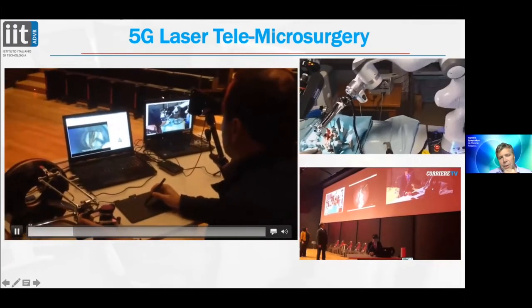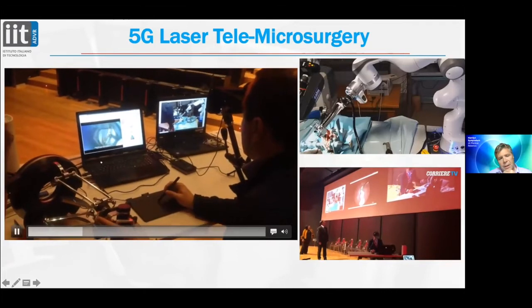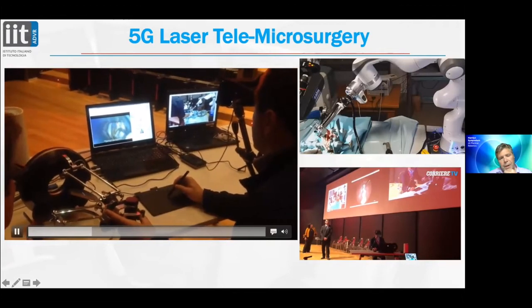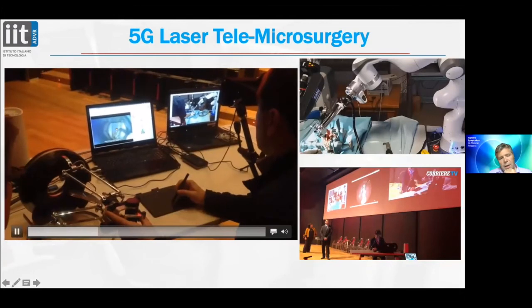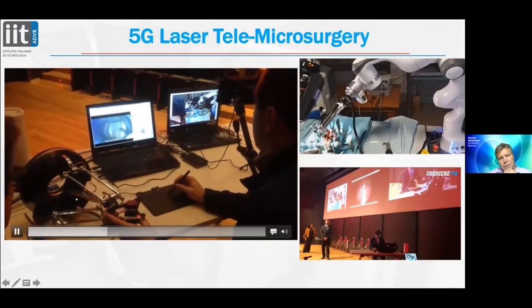This shows him operating in the room, with the head-mounted display. You see here using the stylus, and occasionally you'll see little flashes and sparks. That's the laser being turned on, and he guides the laser with the pen. And on occasions, what you'll see is the forceps, and when he moves the haptic device, you'll see the forceps moving. So in a second, I think he moves this.